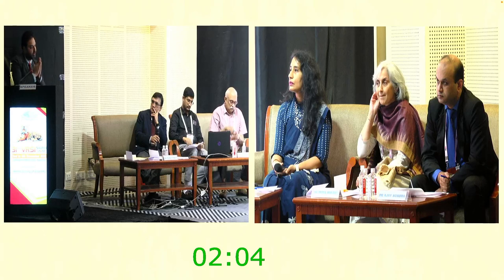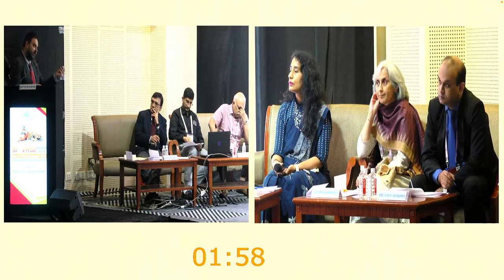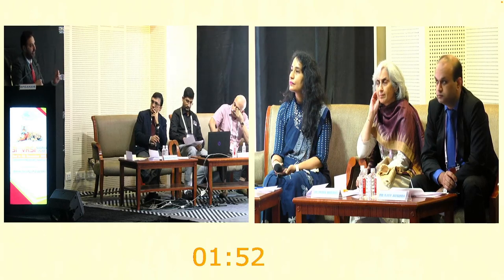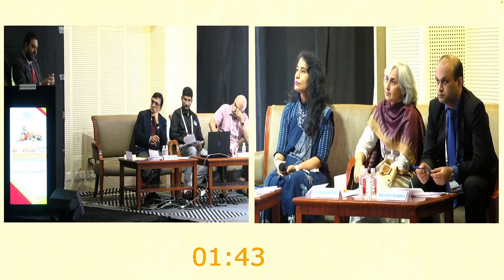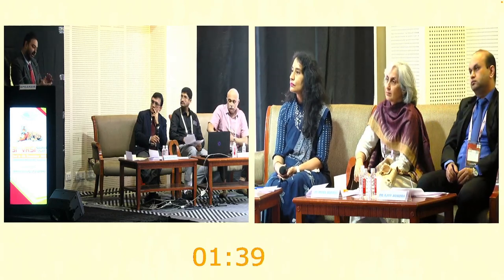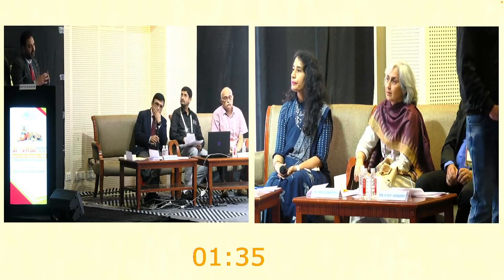So the standard, that part I glossed over. But the standard technique for a diagnostic vitreous surgery, especially if you're doing it for lymphoma, is that after the three ports are put in, the infusion is begun. Not with BSS, but with air. And the first 1 to 1.5 ml of vitreous is taken with the cut rate down to 800 cuts per minute, with air being infused in the eye, because we do not want to dilute what we get.